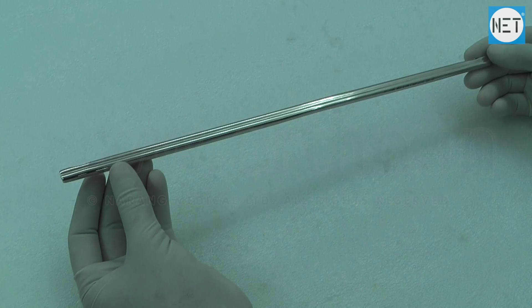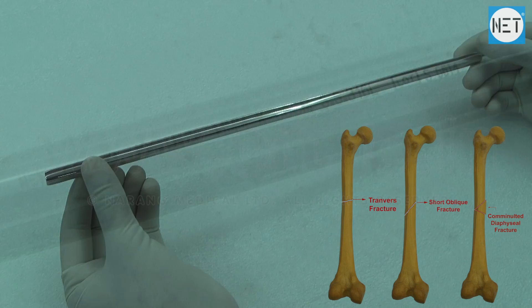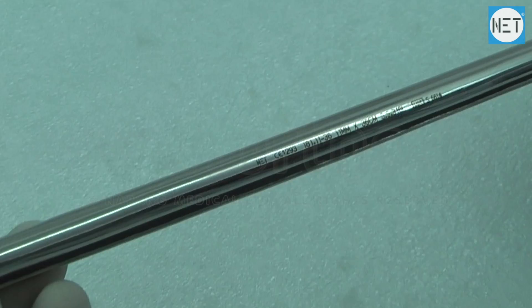Kershner Cloverleaf Nails for Femur Straight. These nails are used to treat simple transverse, short oblique or comminuted diaphyseal fractures of the femur.